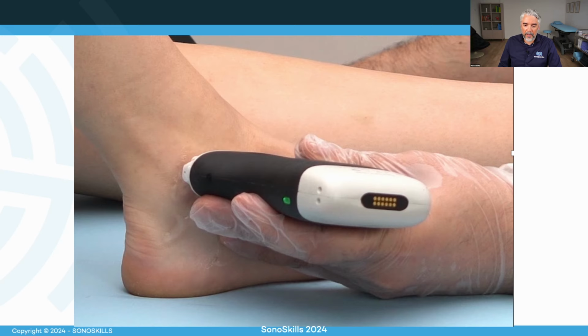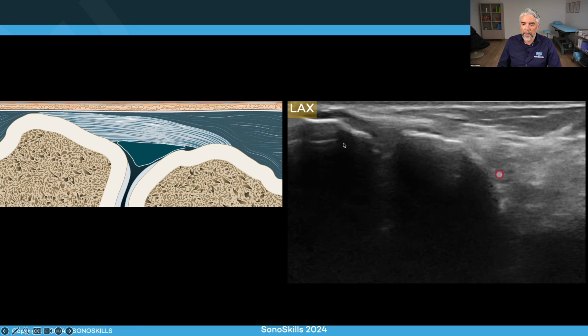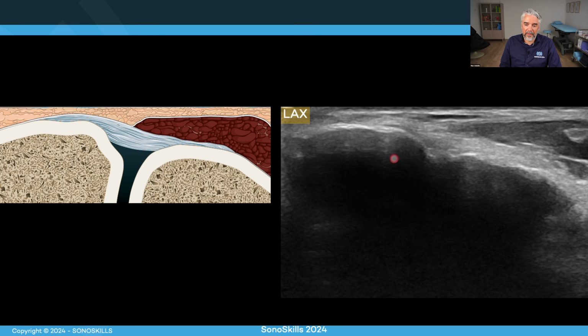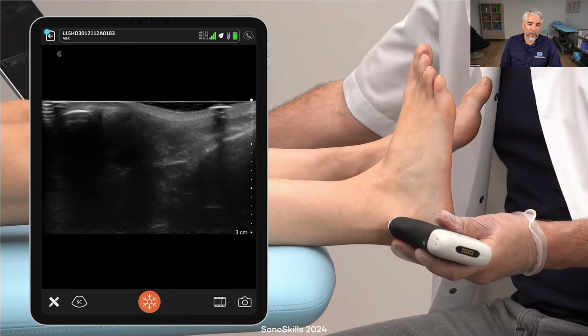For the anterior talofibular ligament, the foot is in plantar flexion, a little bit of inversion, and the transducer is aligned with the plantar foot. And here we can see the talofibular ligament in between the fibula and the talus. This is, of course, the joint, observing the bone quality, bone regularity, and the integrity or continuity of the ligament. Do we see any calcifications or avulsions or effusions? That is what we're going to observe. And if we turn the transducer more diagonally, we can also view the syndesmosis and the tibiofibular ligament, especially if we stress it under dorsiflexion and external rotation.